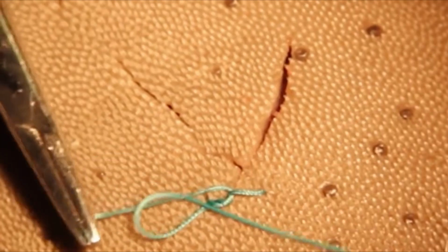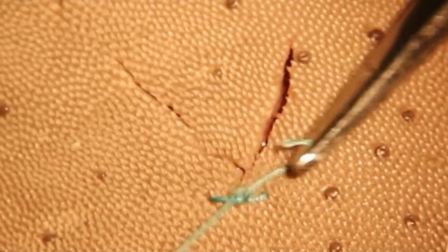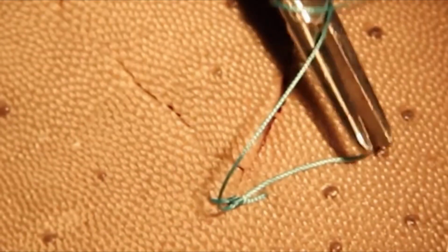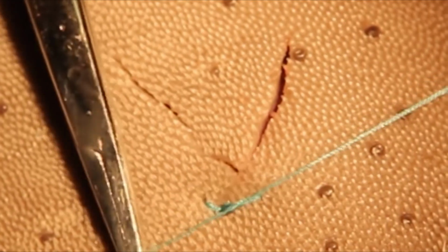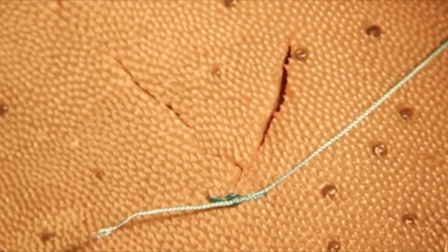Secure the knot with a square knot, keeping the hands low and flat so each throw lays correctly. Alternate throws to keep the knot square and flat. When done correctly, the corner lies flush with the wound edges. The tip is supported from underneath, and the suture is not strangling the apex. That is one corner stitch.